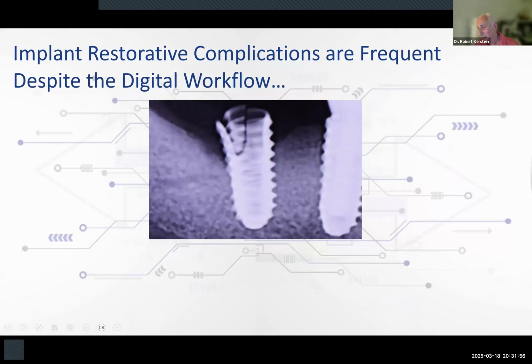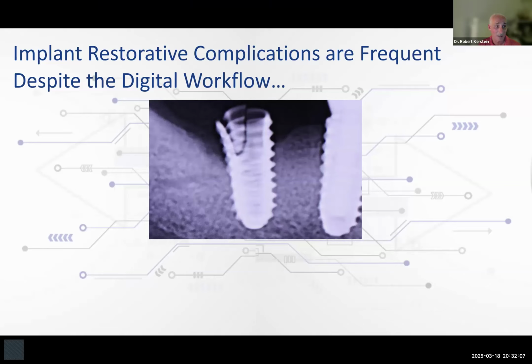Okay, so that's a little bit of the introduction on what's available to you. Now let's talk about complications. As you all probably know, implant complications are so frequent, despite all the advances in the digital workflow, that they actually outpace conventional dentistry.